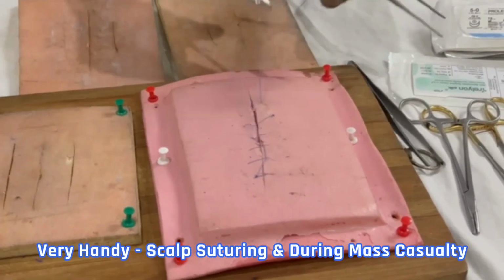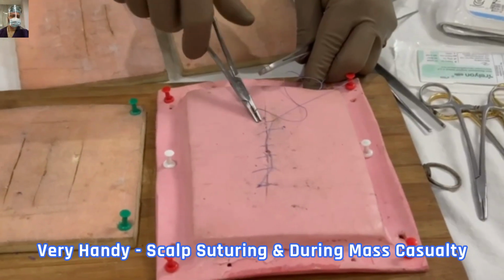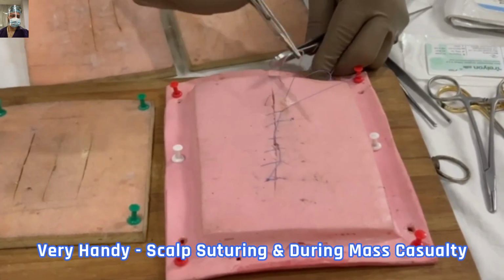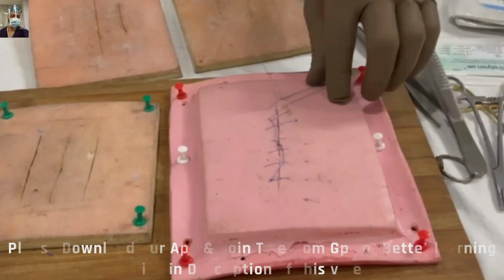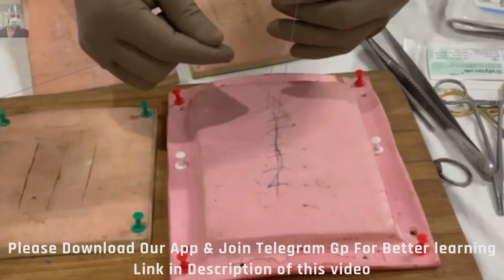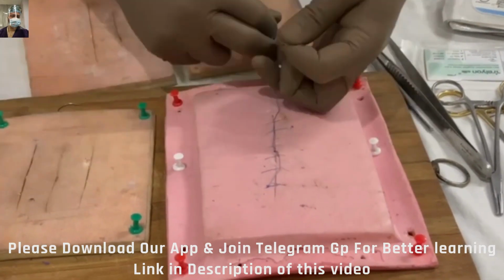Again, for the entry and exit, for the sake of demonstration I am taking the bites on the two sides of the incision at the same time, but it's not recommended. You have to practice taking one side at a time, then come out on the other side, and just don't follow this thing.